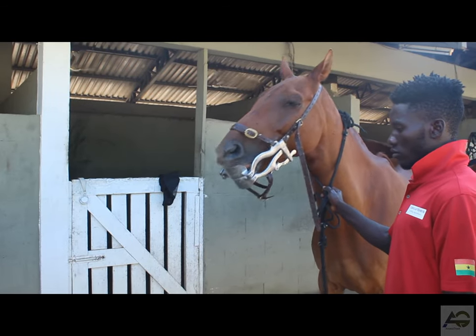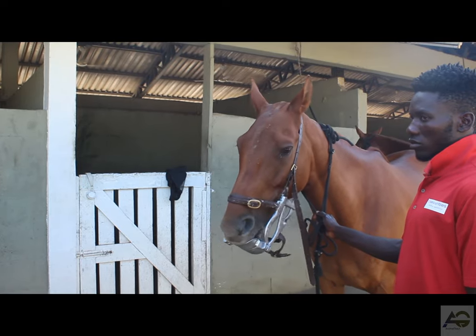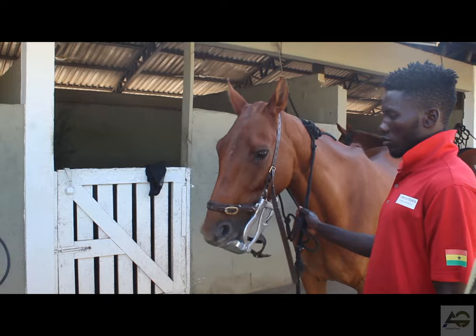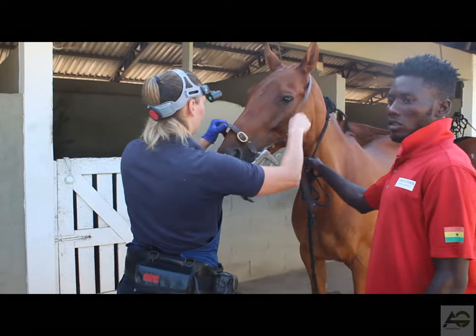Conclusion: Floating a horse's teeth is a simple and effective way to maintain their oral health and prevent dental problems. Regular dental care is crucial for the overall well-being of horses, so make sure to include floating in your routine equine care plan.